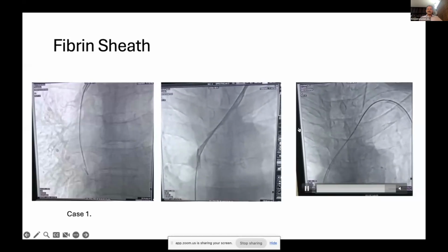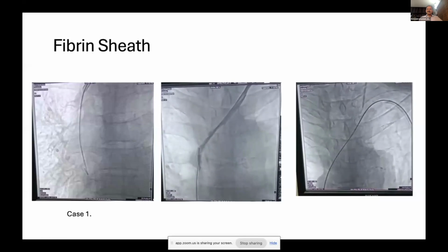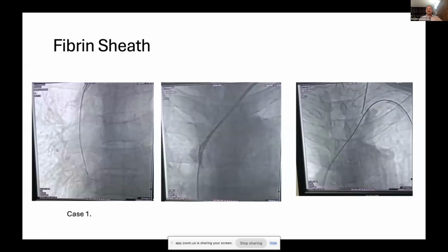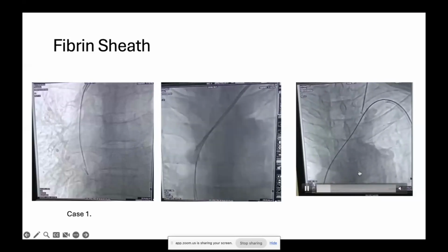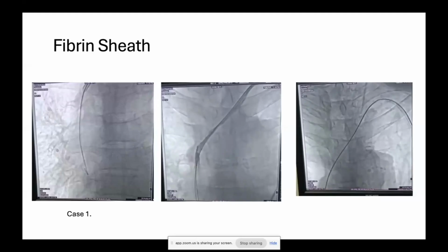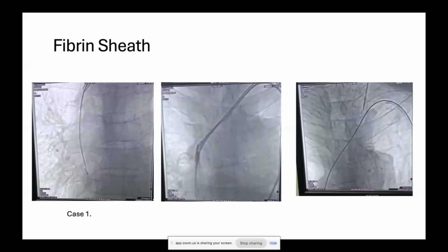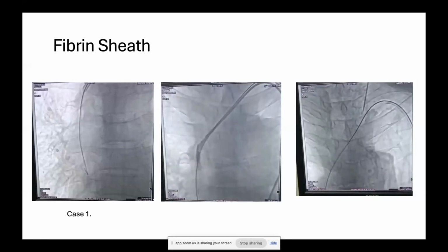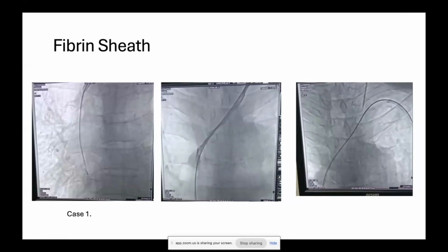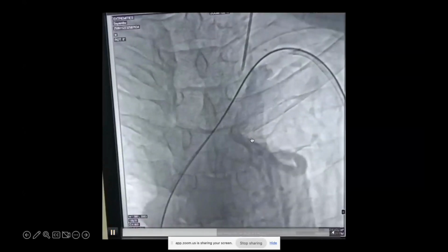So we pulled the catheter up, and since we wanted to avoid the same track of fibrin sheath, we wanted to create a new cannulation site. We went ahead with the left IJV, again a new cannulation site, and we did a contrast study. We can see multiple collaterals, and there was hardly any flow in that site. So we were left with no option but to maintain the same tunneling and same catheter site. This new cannulation site contrast study showed complete collaterals and a blocked left IJV.